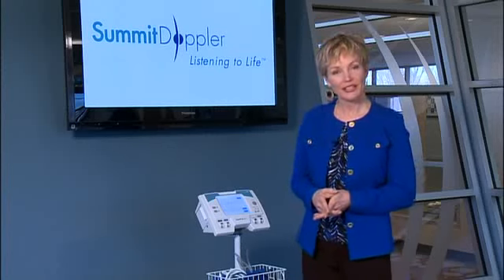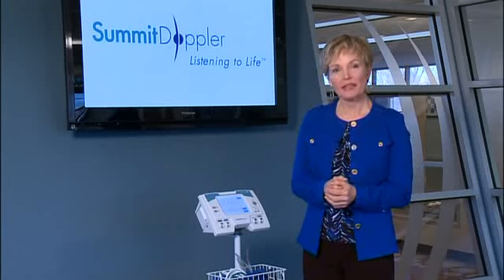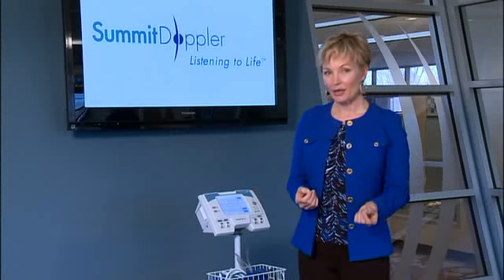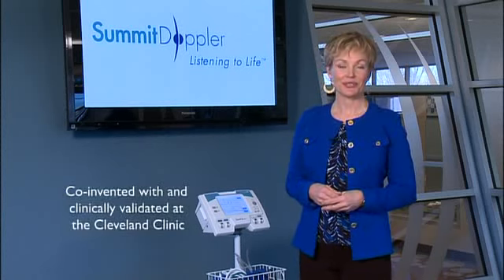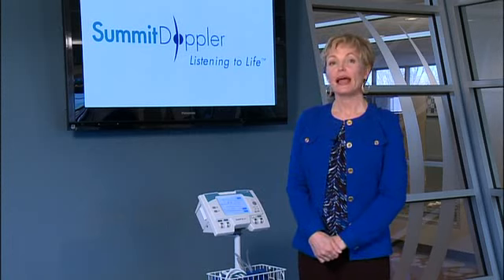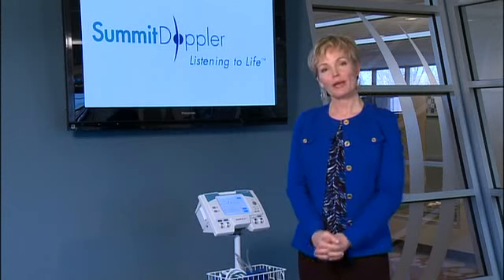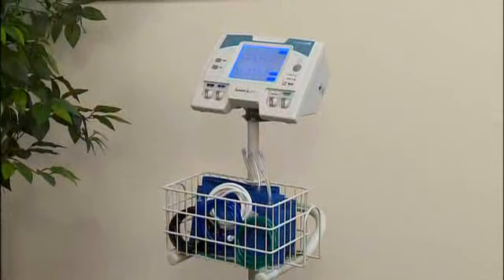Striving to provide new technologies to better serve the needs of healthcare providers and patients, Summit Doppler developed the Vantage ABI. This innovative cuff-based system uses digital Fourier oscillometric, or DFO, waveform analysis, which Summit Doppler co-invented with researchers from the Cleveland Clinic, where the first validation study was also performed. This new technology is a significant improvement in ankle pressure determination and PAD assessment over traditional forms of oscillometric ankle pressure estimation. The Vantage ABI has everything needed to conduct fast and accurate ABI exams.